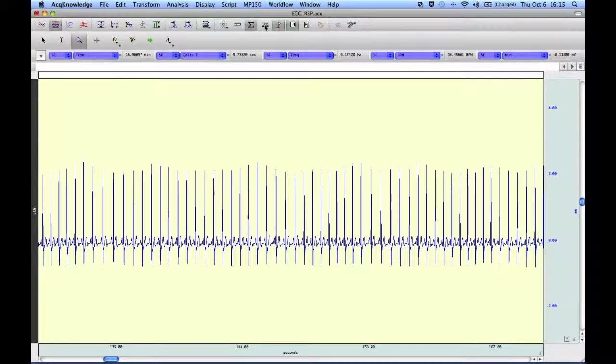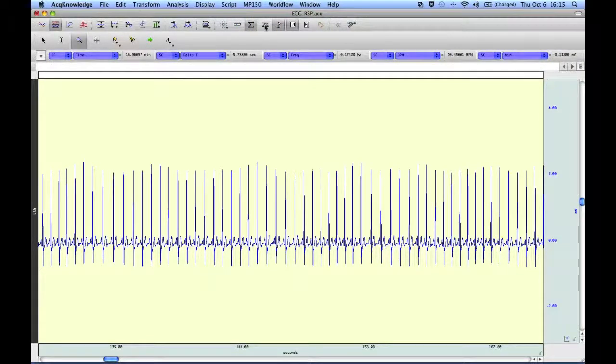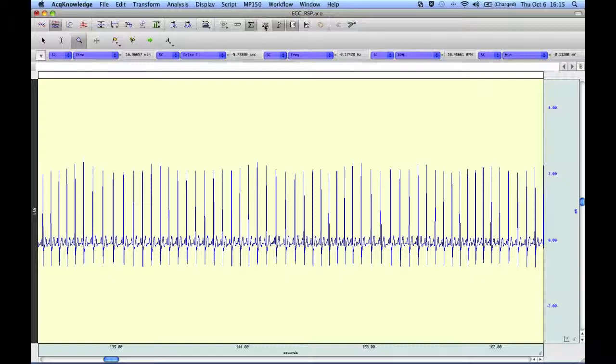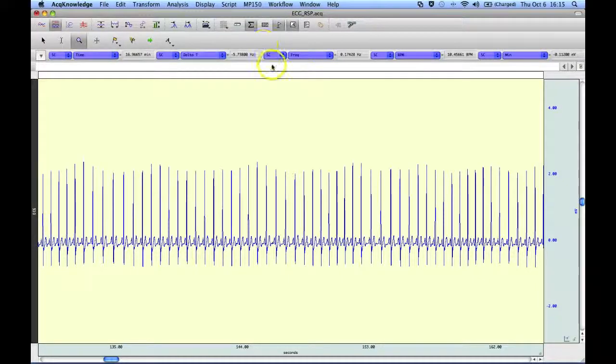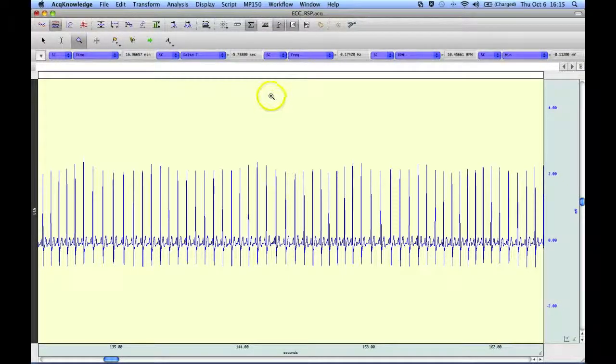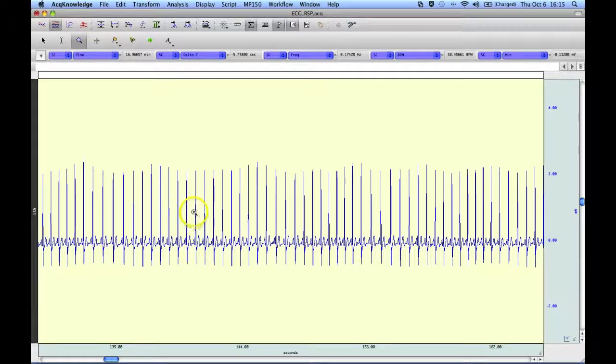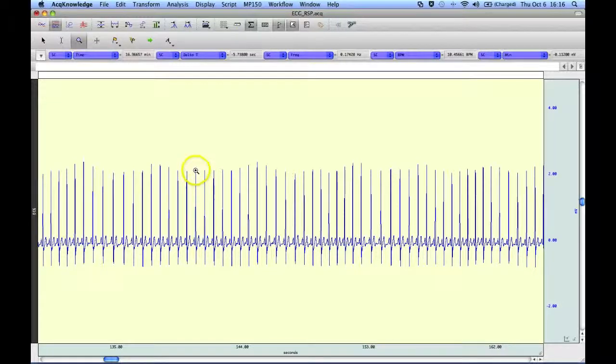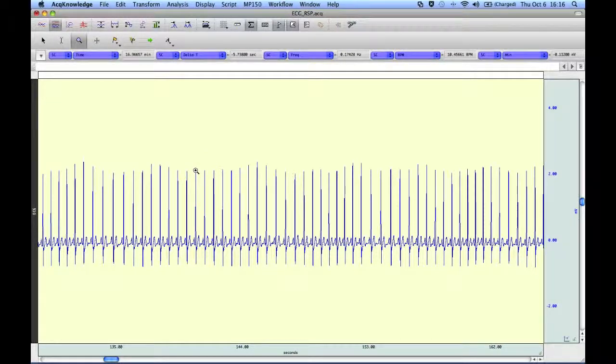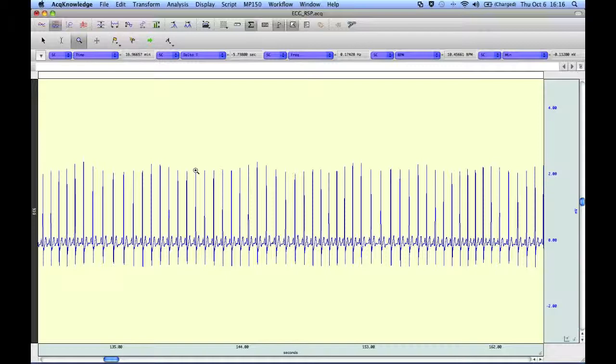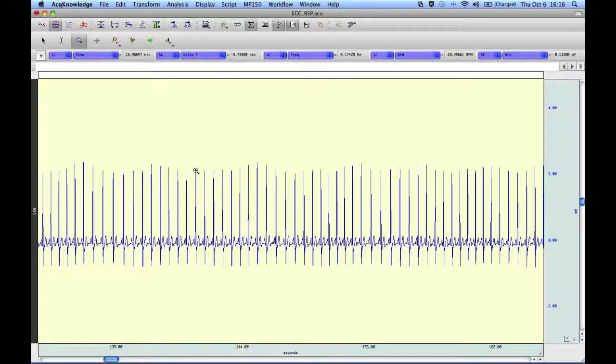The following screencast will provide a demonstration of Acknowledger's waterfall plot routine. The waterfall plot routine works off of either a peak in the data. In this case I'm going to be using an ECG file, so the system will use the peak of the R wave to center the plot, or it can use events in the data as the center point.